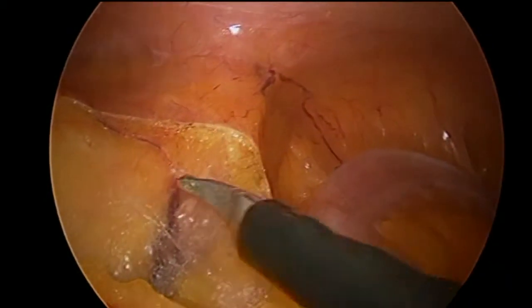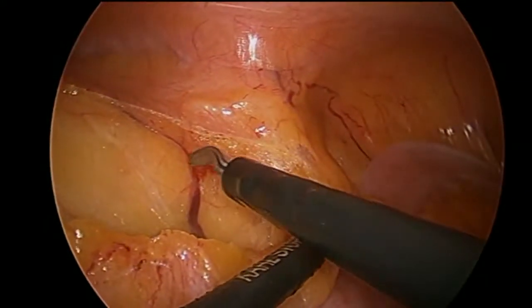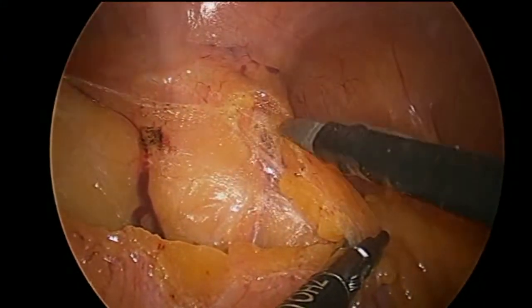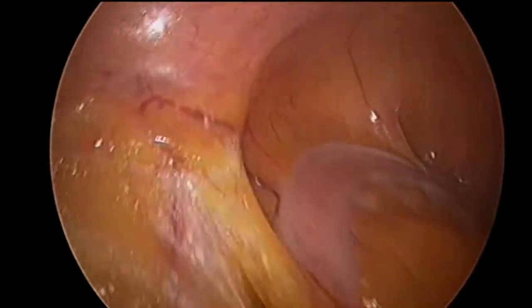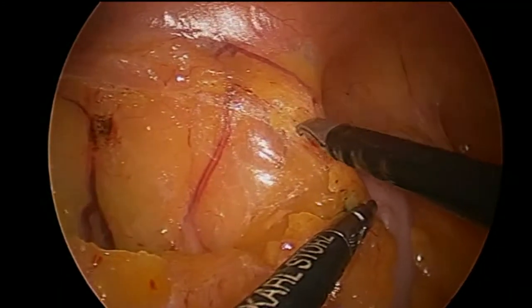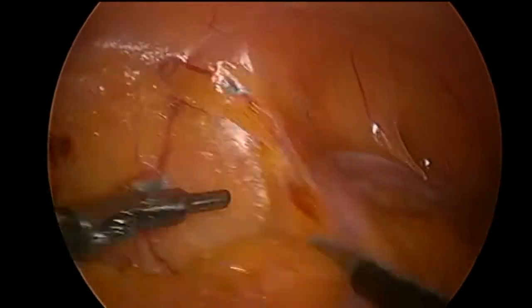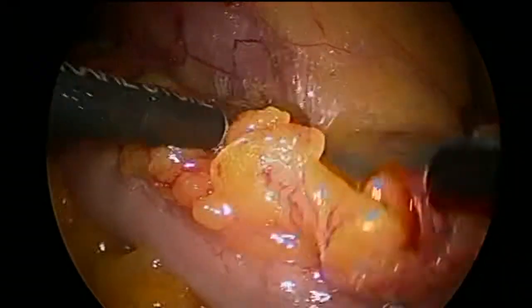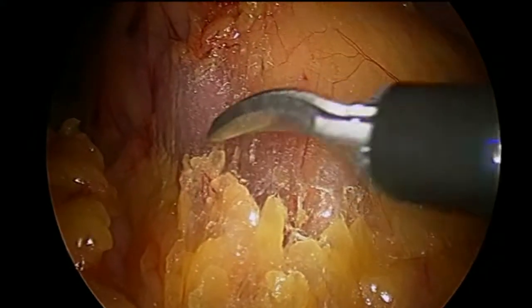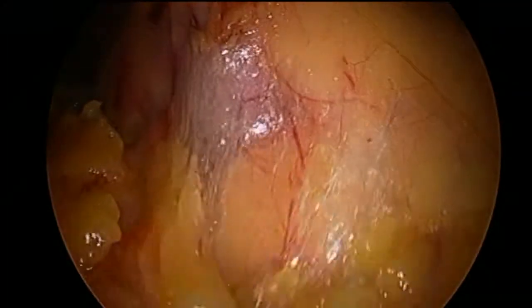Particularly in dissecting it off the iliac vessels and the iliac bifurcation, which is not relevant in nephrectomy for renal cell carcinoma. But sometimes even when you're doing this nephrectomy, you can see the common iliac pulsation when you're going down to the lower area. Be careful, especially in smaller patients — those who've had kyphosis, scoliosis, and even paraplegics or patients who've been in wheelchairs for long periods of time — their entire body shape is different, and so you have to be prepared for anything.